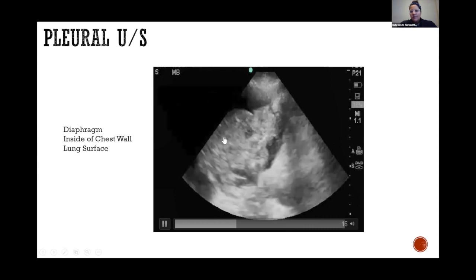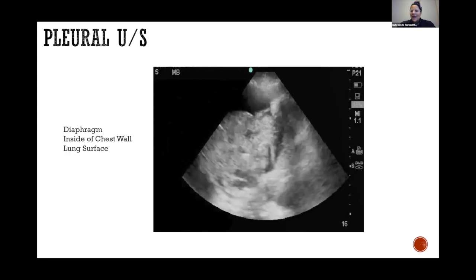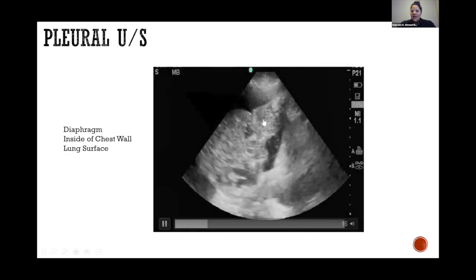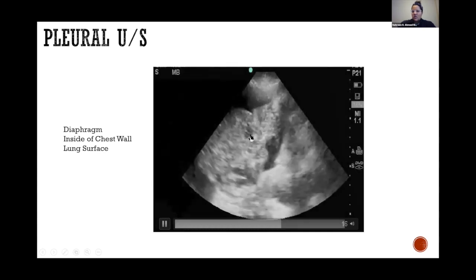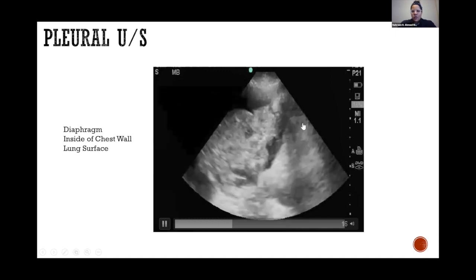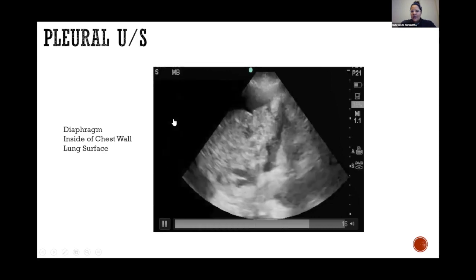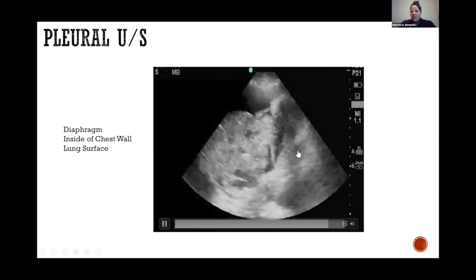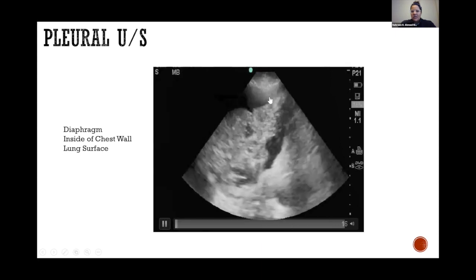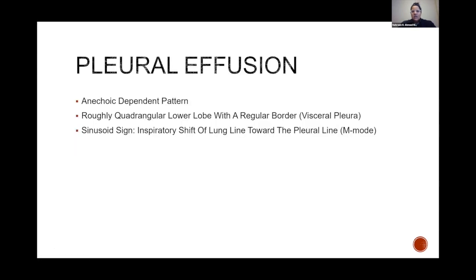And remember, in lung ultrasound, if the lung is normal, it's aerated, and you're not really seeing the actual lung itself. However, here you're seeing a condensed lung. Either that's because there's pneumonia, or there's compressive atelectasis because of the fluid that's around. Again, remember, the dot is to the left of the screen. Everything cephalad is to the left, everything towards the feet is to the right. So here is the diaphragm, this is either liver or spleen, depending on what side of the body we're on, and we're seeing a condensed lung here.